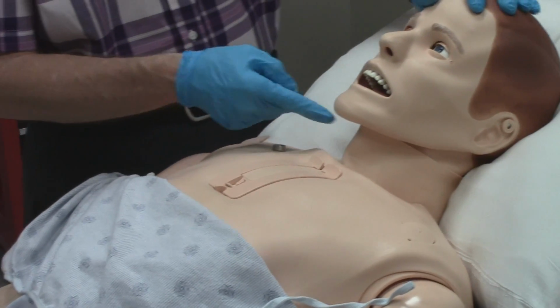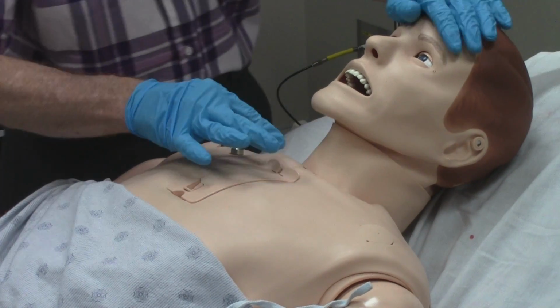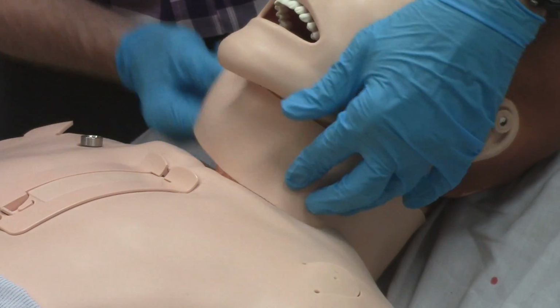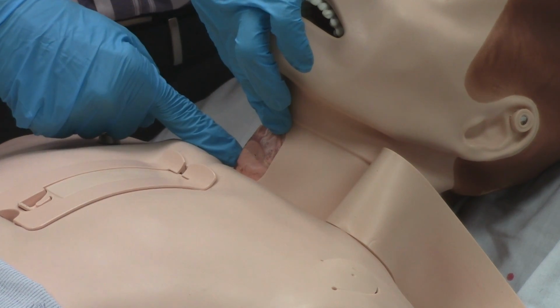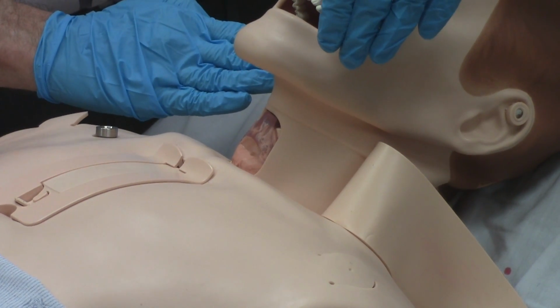The SimMan also has the correct anatomy in his neck to perform a surgical airway. You'll notice that there's this skin collar on his neck. You can cut through the skin collar and through the underlying piece of pink tape to access the lower airway and bypass an upper airway obstruction.